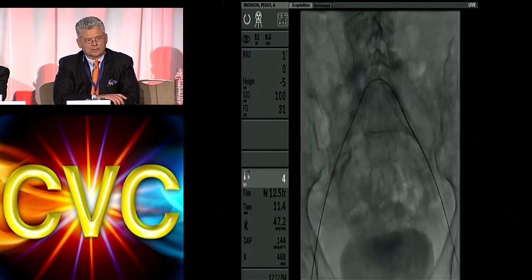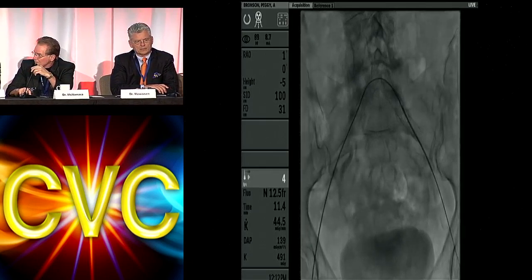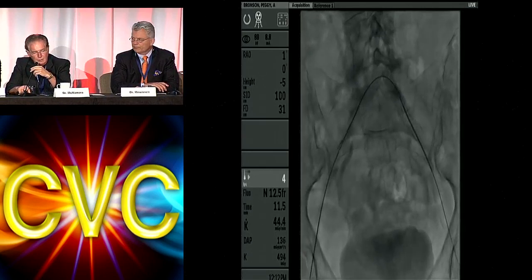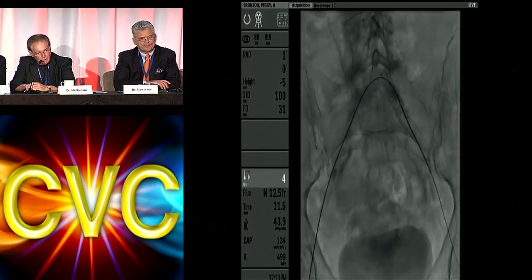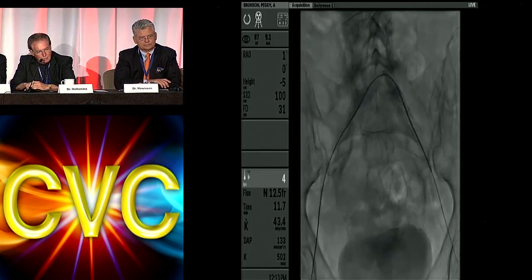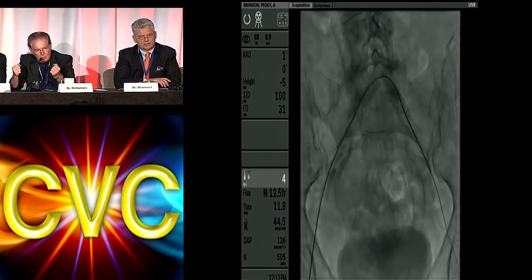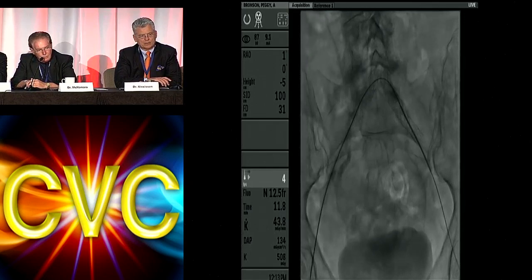And I think the problem was probably going on the right side to the strut. Amir, I wonder if you could snare the wire that's in the left groin and then introduce something like a Van Andel over that and bring it on up, and see if by holding the wire taut on both sides... Okay, that's one option.